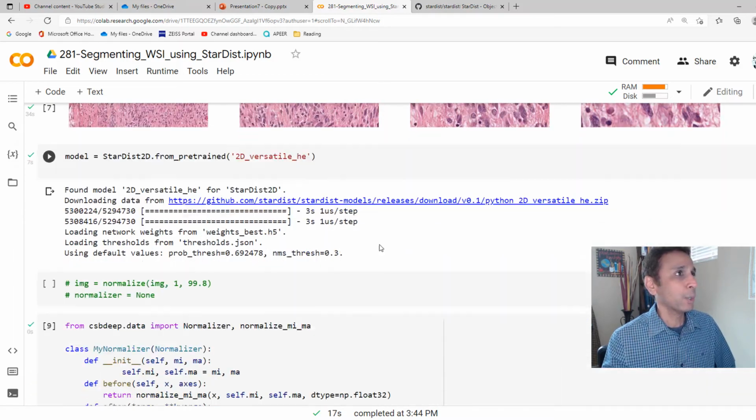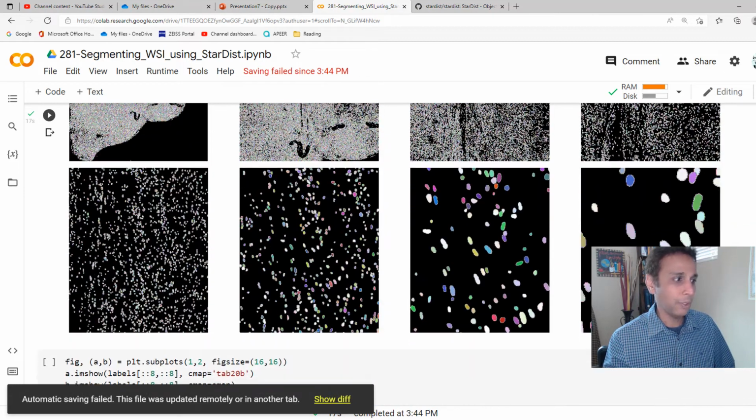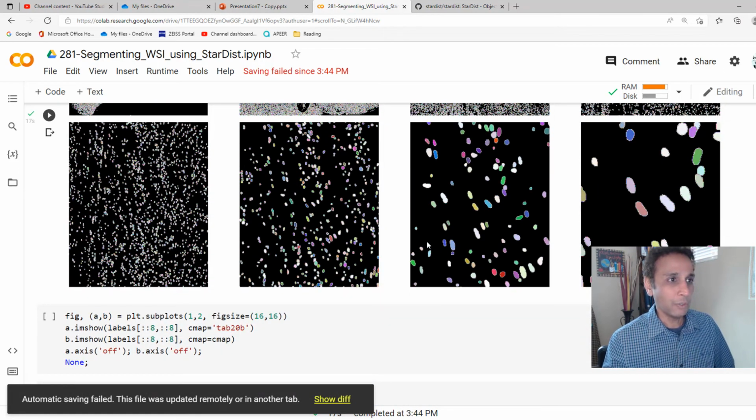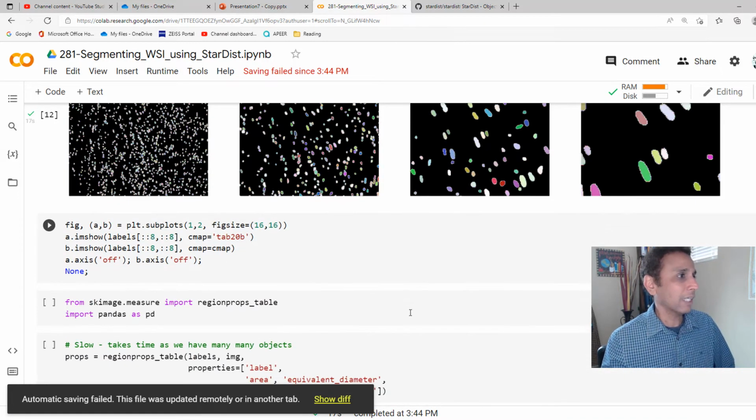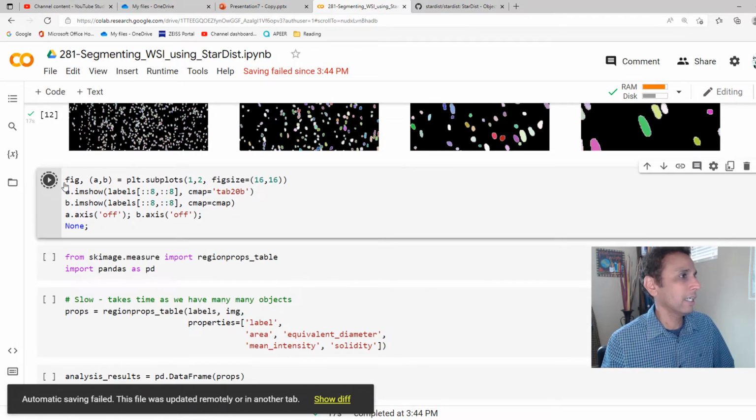Yeah. So let's go down, and there you go. So you have hundreds of thousands of nuclei at various stages, all the way coming down to this stage. Ignore that message for now. Okay. So now let us go ahead and look at some of these subplots.